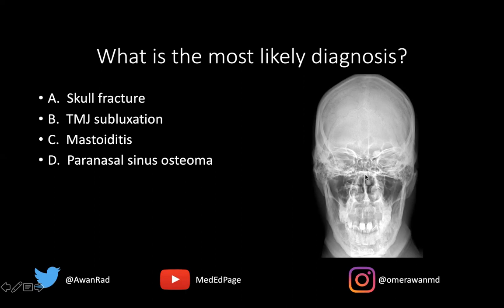These are the ethmoid air cells, the sphenoid sinuses, and then these are the frontal sinuses. The right one is normal, but if you take a look at the left frontal sinus, there's this ovoid dense lesion here, which represents a left frontal bone osteoma.